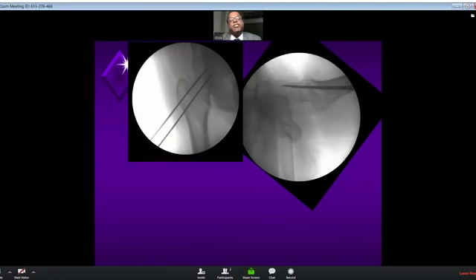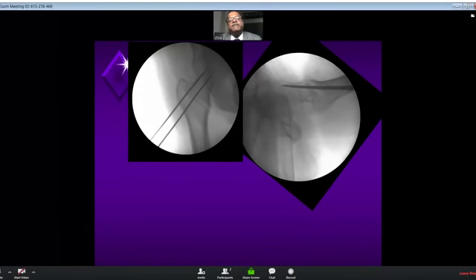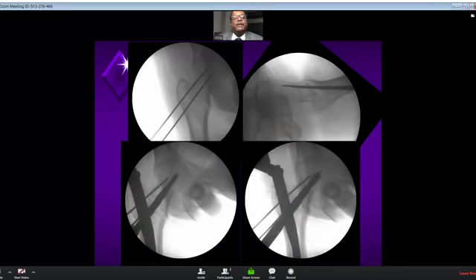This is another case. And I go a step further. Even an undisplaced fracture, a cracked potential fracture also, I fix with K-wires. The reason is when I insert the nail or the reamer from the top, that will cause separation superiorly and lead to varus. To prevent that, even in an undisplaced crack fracture, I fix these fractures properly with two K-wires which are placed anteriorly, and then I'll go ahead and do the nailing, whatever I'm comfortable with. Here in this case, I have used a PFN A2.